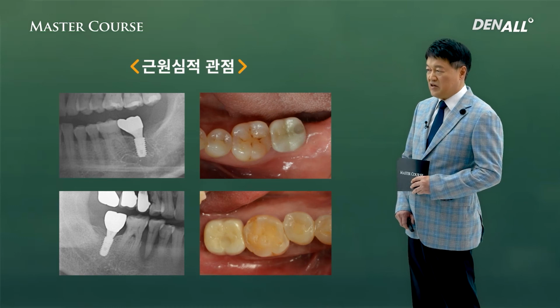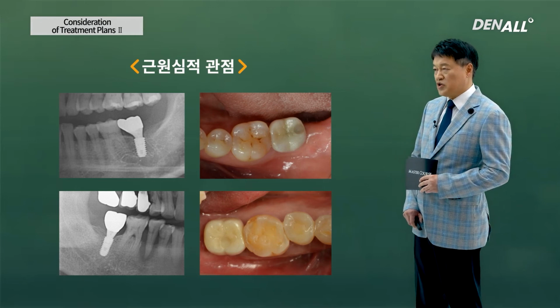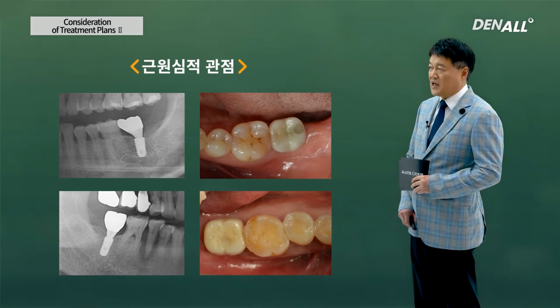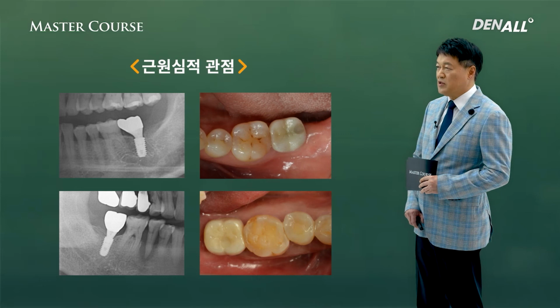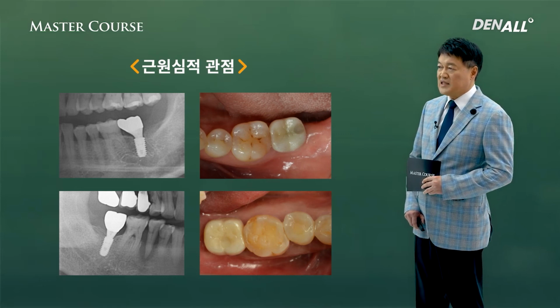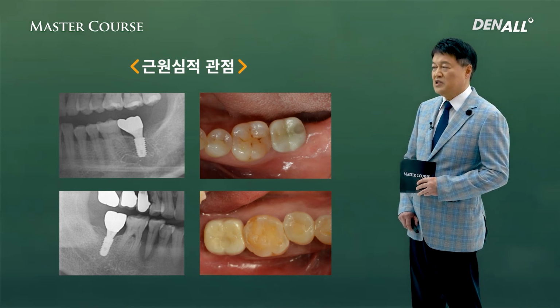in the below case, mesial tilting is done similar to adjacent natural teeth, and the prosthesis hole direction is in the center. However, if the mesial tilting is not done, the hole direction becomes distally inclined and a cantilever effect can occur. So you need mesial tilting similar to natural teeth.